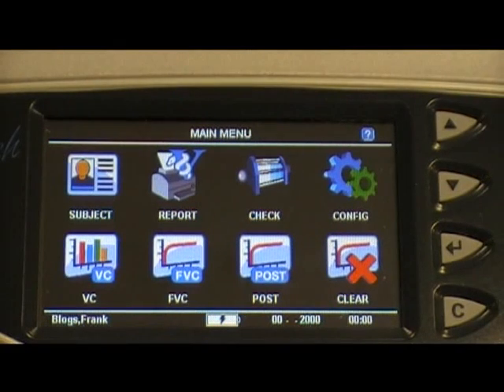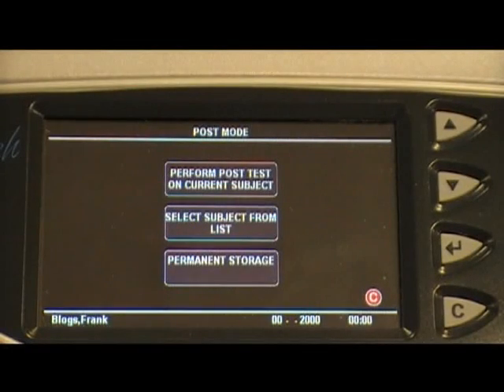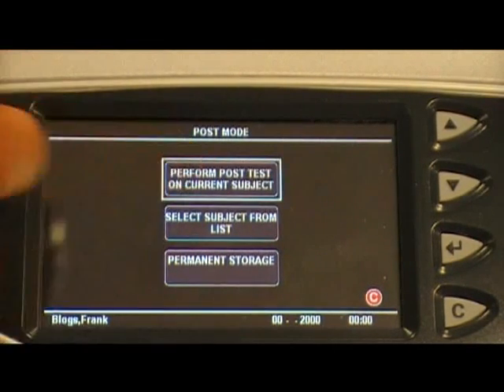The AlphaTouch can also test for reversibility of airways obstruction. To perform this test, click the post icon from the main screen, then click perform post test on the current subject from the displayed options.